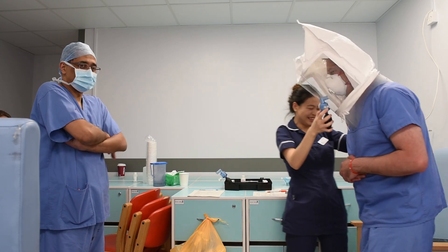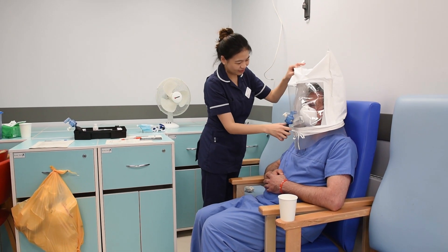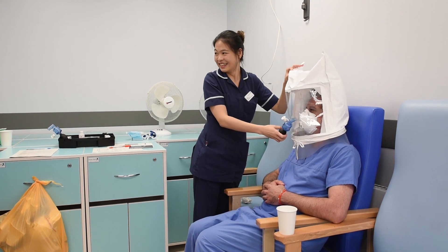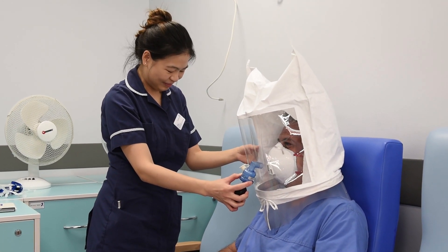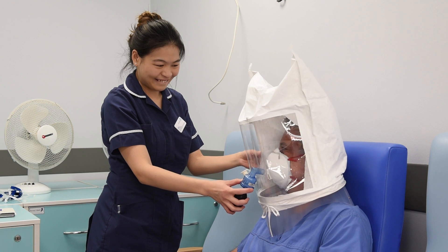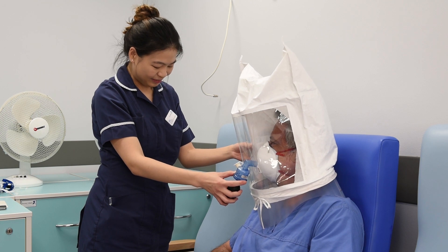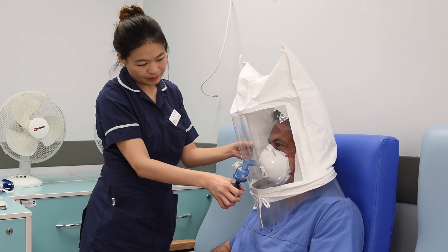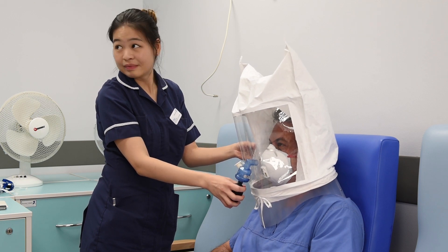Okay, please sit down. That's enough. Normal breathing for now. How are we doing? Fine. It's lovely to do this. By now the smell would be very severe, so the bitter taste in my mouth is coming from that. Certainly when I did it, when you lift the mask up at the end of the test, you're going to be hit by it.